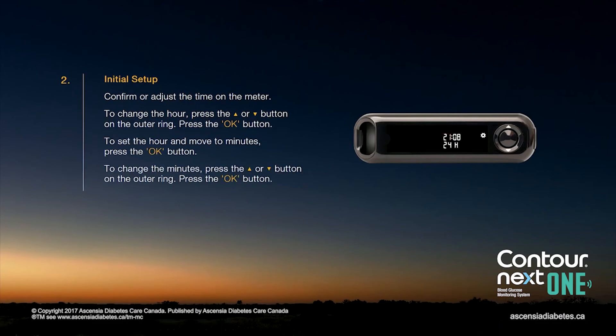Confirm or adjust the time on the meter. To change the hour, press the up or down arrow button on the outer ring. To set the hour and move to minutes, press the OK button. To change the minutes, press the up or down arrow button on the outer ring. Then press the OK button.